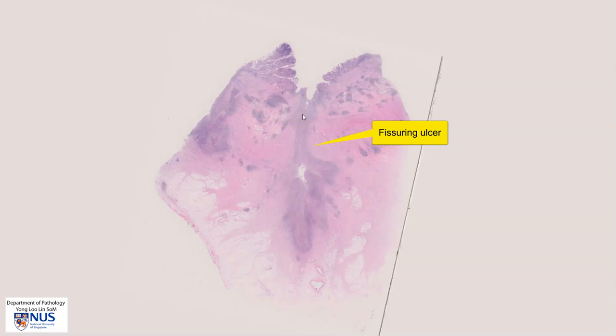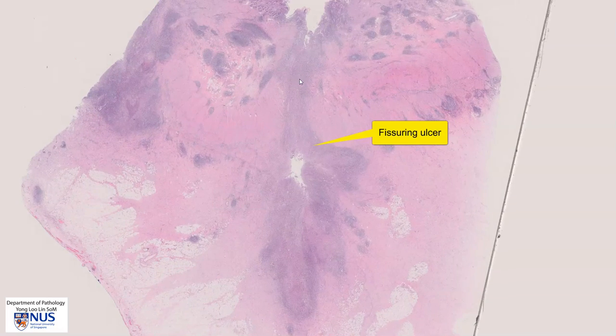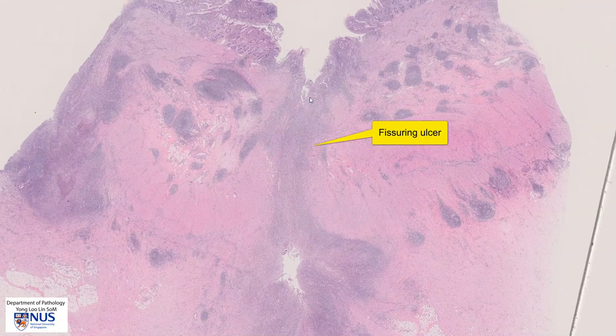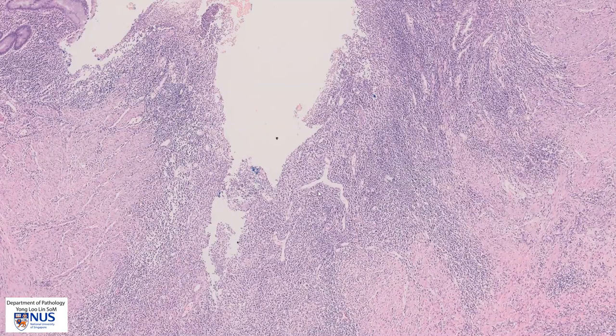It goes through the submucosa, through the muscularis propria, and right into the subserosa. This is known as a fissure or a fissuring ulcer. We can see here the wall of the ulcer, which is composed of inflamed granulation tissue, and we can see inflammation all the way down into the subserosal layer.